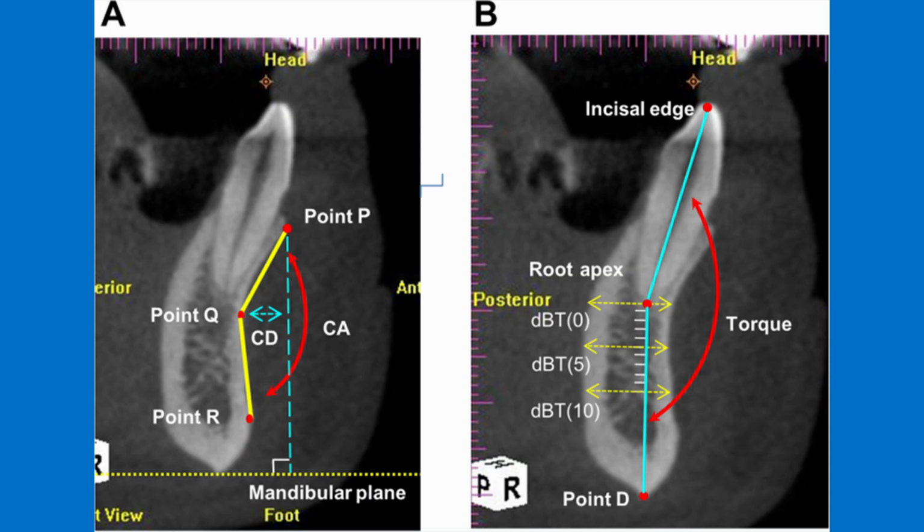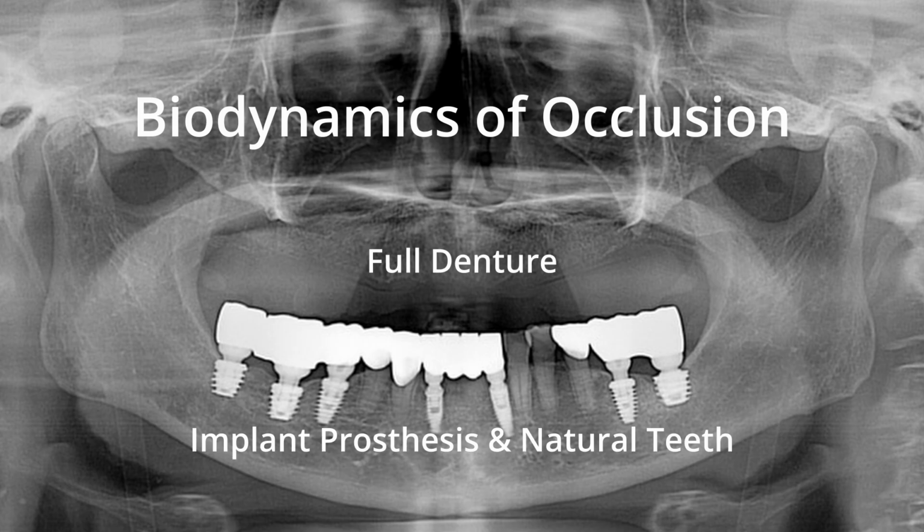However, when the alveolar bone is completely resorbed, bone heating during drilling and perforation of the lingual bone plate may occur, right? In such cases, the long axis of the placed fixture tends to shift toward the lingual side. That actually makes screw-retained implant prostheses easier to fabricate. This is why AllonX is most commonly recommended for the mandible.